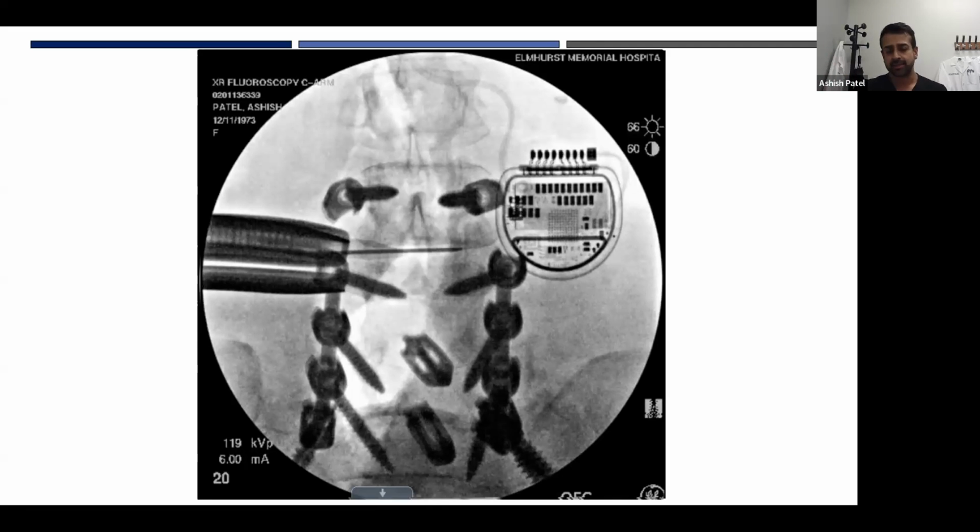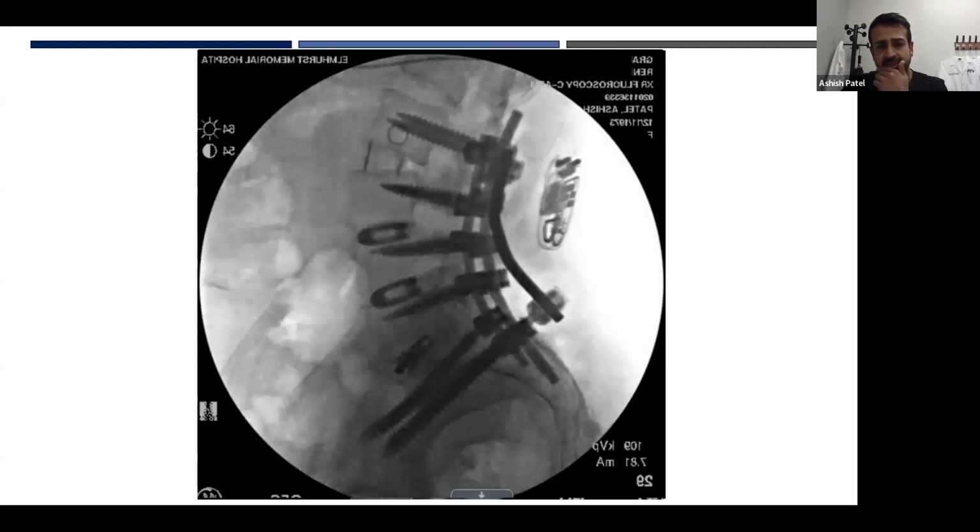But you can go back into the flank and perform a prone lateral as a secondary step without changing the patient's position. And we placed a 20-degree hyperlordotic implant in there. You can see the tab in there in case we needed to fix the spine. In this case, the ALL was still a barrier there, so we didn't really need to put a screw in it.